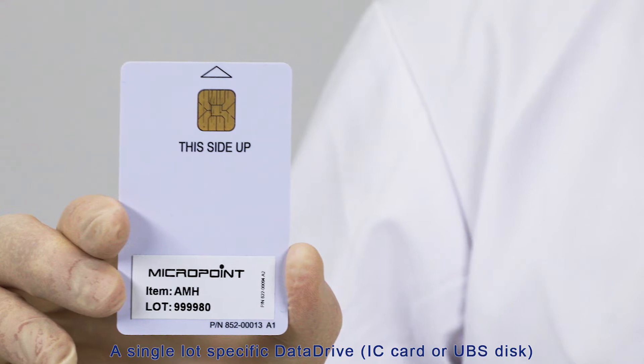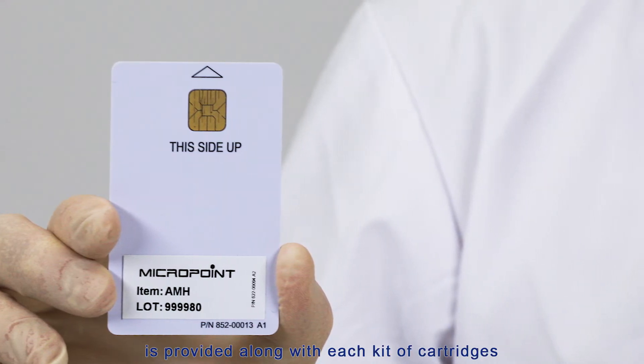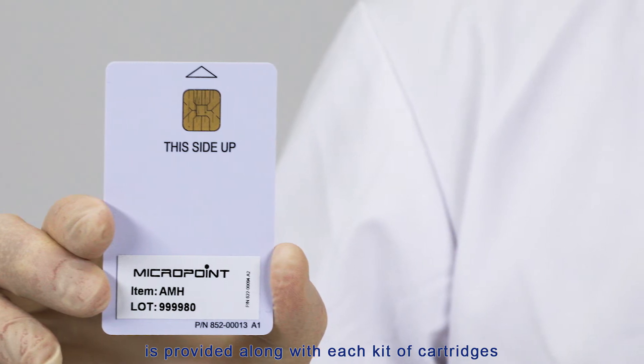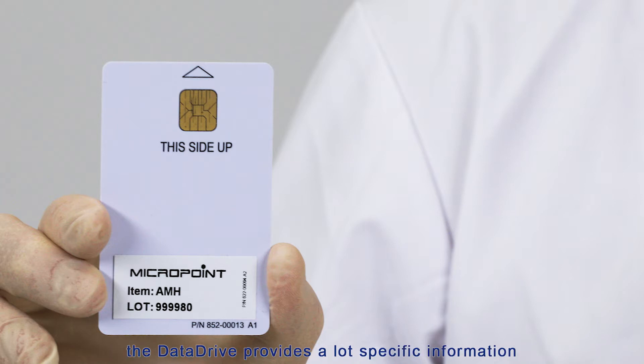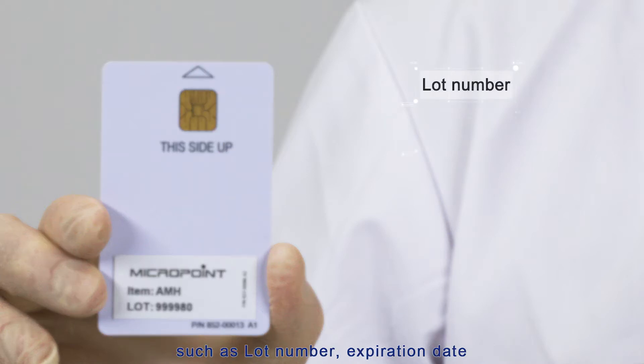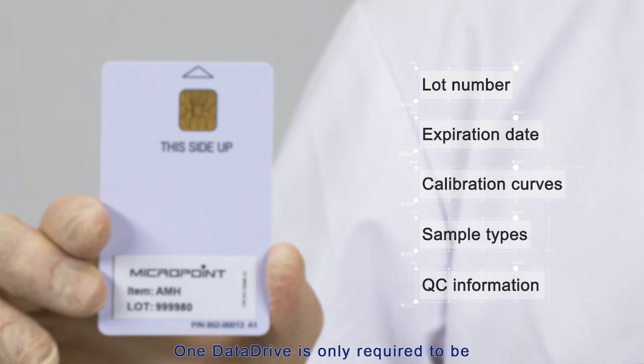A single lot-specific data drive IC card or USB disk is provided along with each kit of cartridges. Prior to running any cartridges, the data drive must be installed into the M-Labs Immunometer. The data drive provides lot-specific information such as lot number, expiration date, calibration curves, sample types, and QC information. One data drive only needs to be installed once for each lot, and the M-Labs Immunometer can store data drives for different lots.